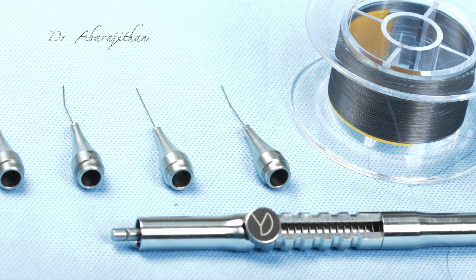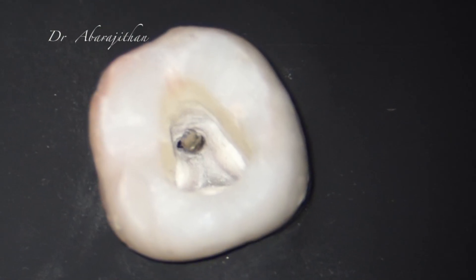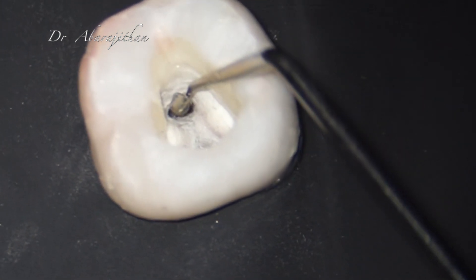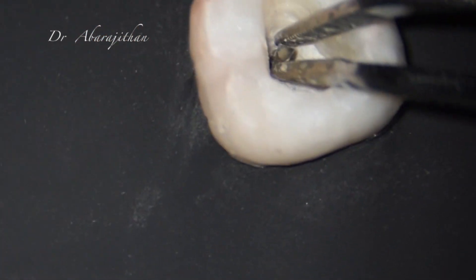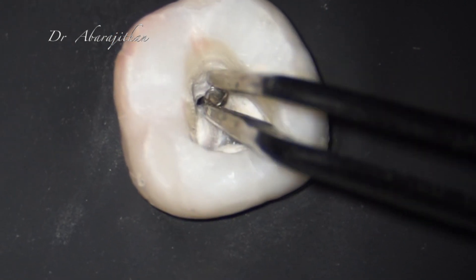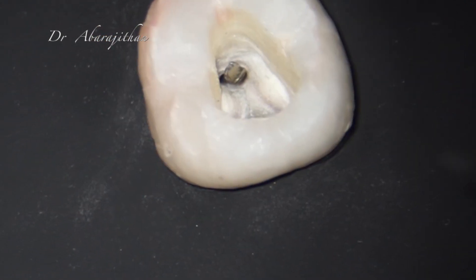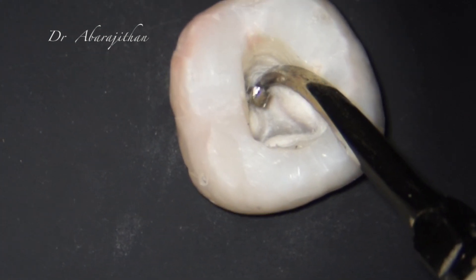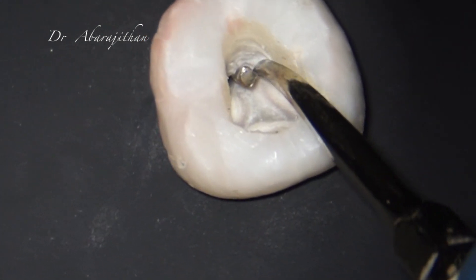Before we talk about the product, we need to know the indication for using these micro loops. To use these micro loops, the instrument has to first be mobile or loosened by using ultrasonics. Only after the instrument is exposed and only when the instrument is moving will these loop methods be useful.